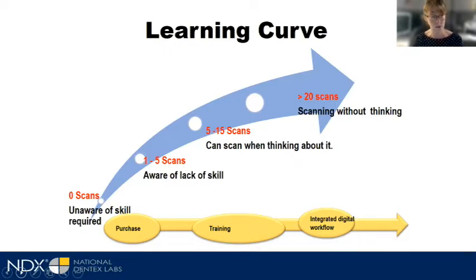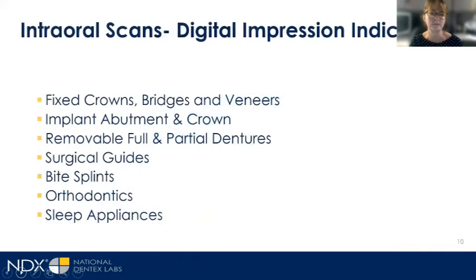And then there are younger folks, probably such as yourselves, that have grown up with hand-eye screen technology. It's different than just hand-eye coordination. You really need to be able to look at the screen and glance in the oral cavity, or vice versa, glance at the screen and look in the oral cavity while moving the scanner. So for some people, that's a little bit of a struggle. It feels like they're driving backing up in a rear view mirror. So just know that that's normal, right? Just because one colleague has it down pat after 2 scans and it takes you 10, it's not wrong. It's not bad. It's very, very normal in the industry.